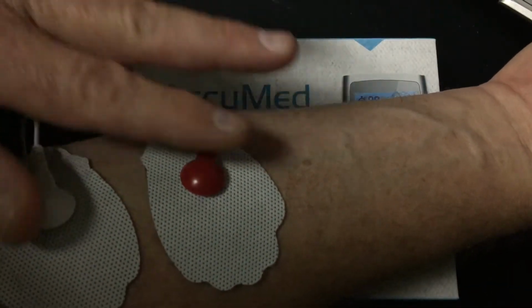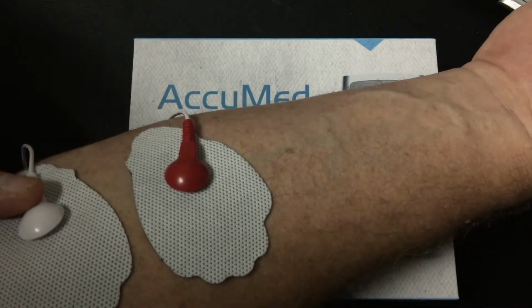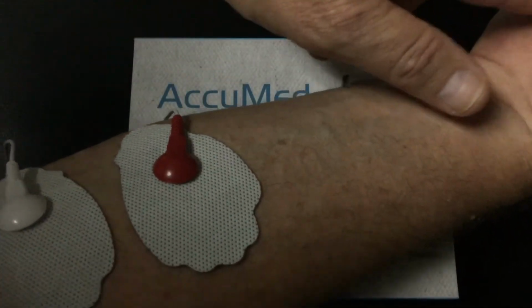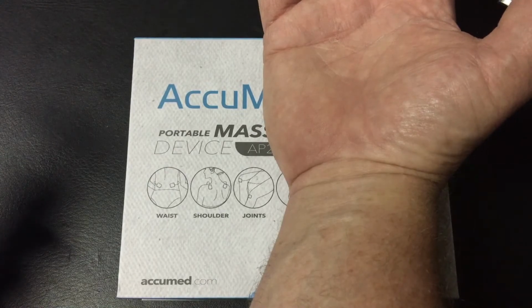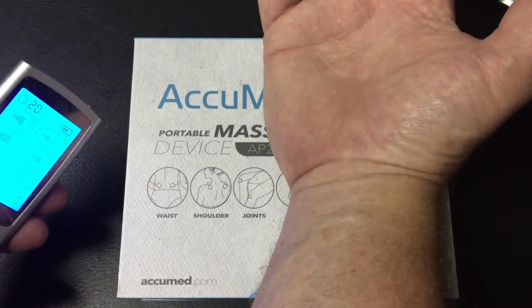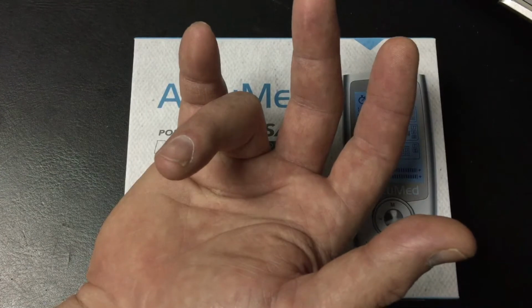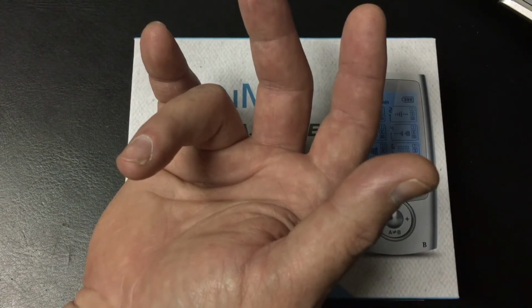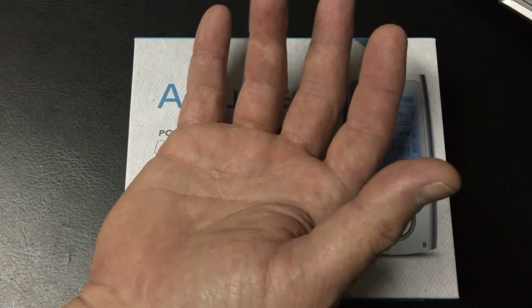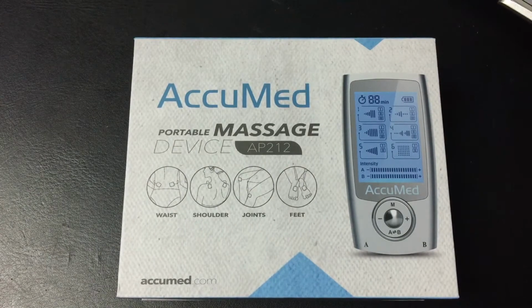I'm just going to show you real quick how that works. The electrodes are attached to my arm, and this is the area based on my therapy. That's where they told me to place those. The placement actually targets that tendon, and you're going to see as I go. Let me select the mode here. Right now I'm on massage mode, which is mode number 1. I've got that turned up. Now watch my finger. Now that's not me doing that. That's the TENS unit causing the flexion of my finger. Okay, so you get the idea. That was part of the therapy that I did for my injury.